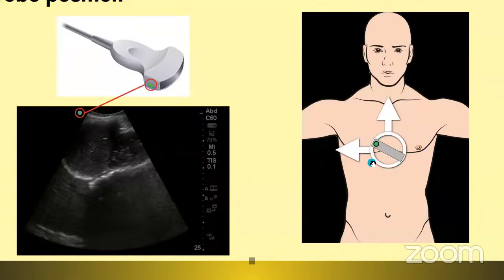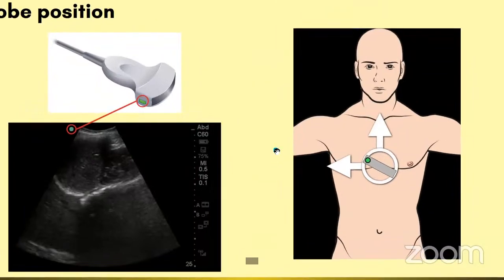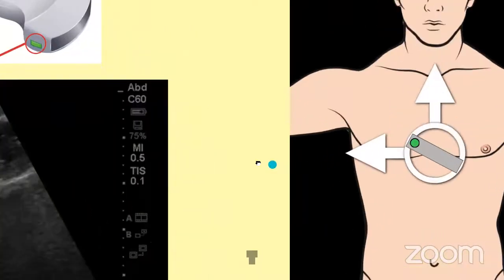Then I won't be able to appreciate which direction my desired organ is to be seen through the ultrasound. If two physicians exchange the probe orientation marker's direction, they might get confused between themselves. So it is essential to follow a convention, right?